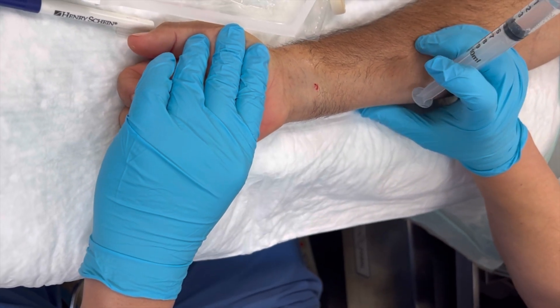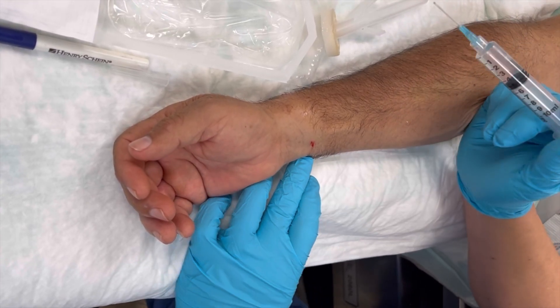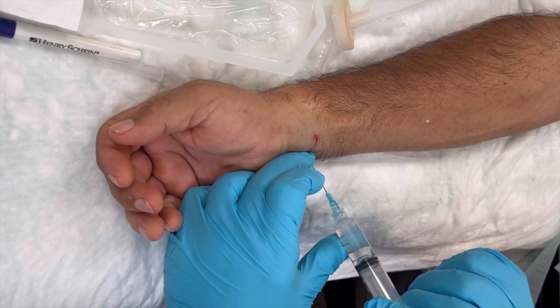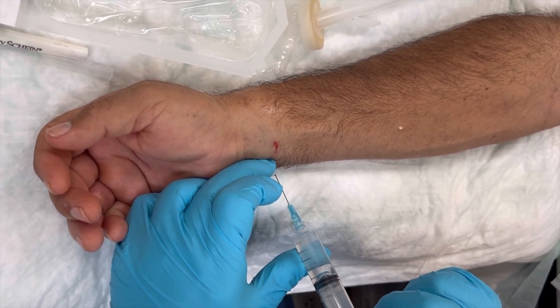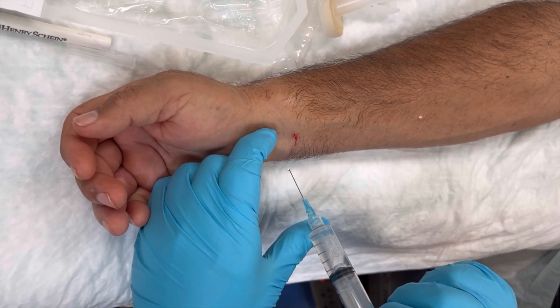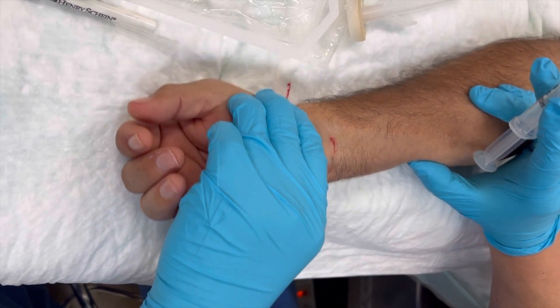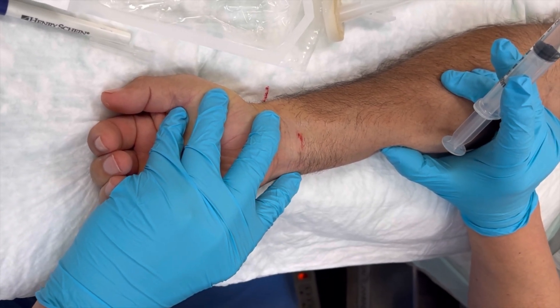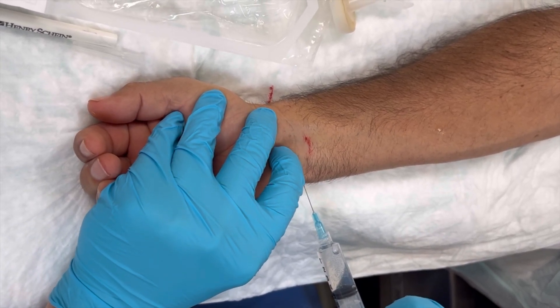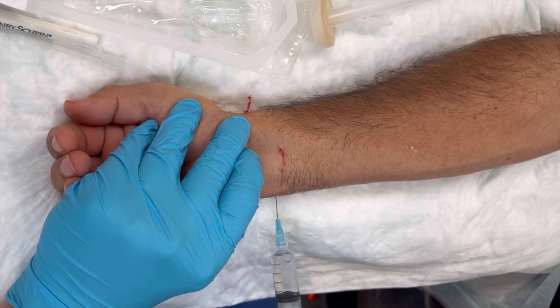Now I'm going to do the ulnar nerve block. For the ulnar nerve, you can palpate the ulnar artery pulse and go just medial to the pulse, perpendicular, in the same fashion. Once you penetrate the retinaculum you will feel the pop and inject 2-3cc's. But often it's hard to feel the ulnar pulse. The easy way is to just feel the flexor carpi ulnaris tendon — there's a tendon here — and inject just underneath the tendon. Or if you don't feel the tendon, go to the midline, advance about half to one centimeter, and inject 2-3cc's.